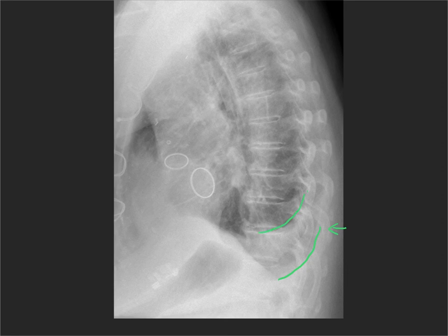Practice this on every chest x-ray you see and you'll soon get the hang of it. I would guarantee that maybe 99 out of 100 chest x-rays you'll be able to tell which diaphragm is which. Thank you.